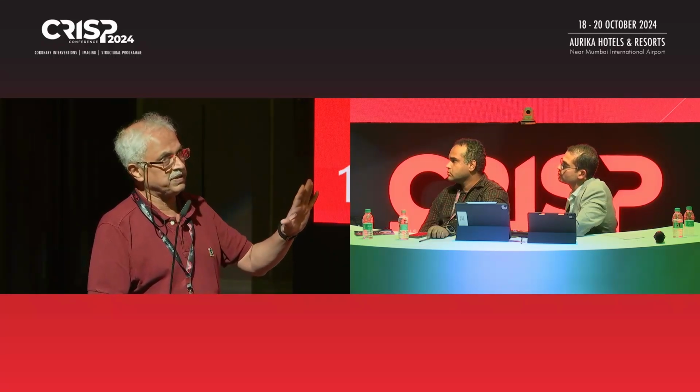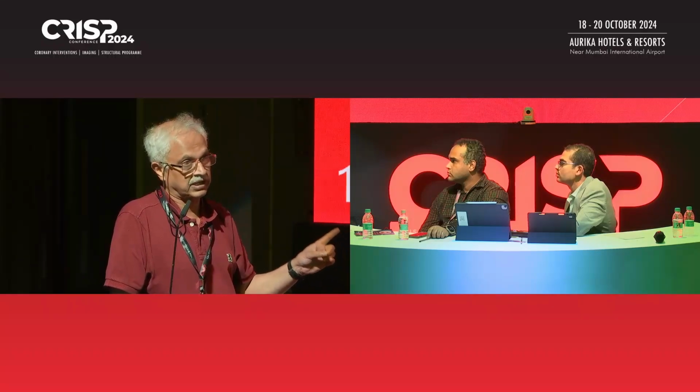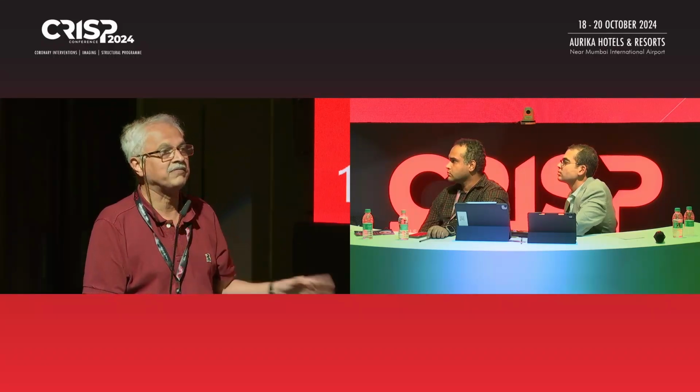So we will interpret PVR or PVR by SVR ratio in the background of the clinical picture. No matter who tells me that no, this is a sure shot, I would look at everything before I decide whether I want to close it. And as I said, when in doubt, a fenestrated device, and when in too much doubt, for a pulmonary vascular disease, I will never close it.